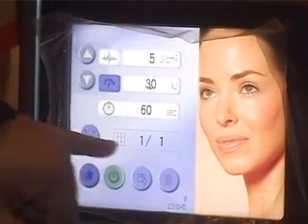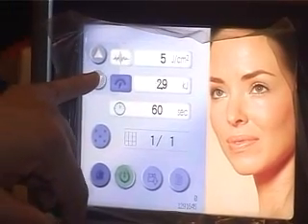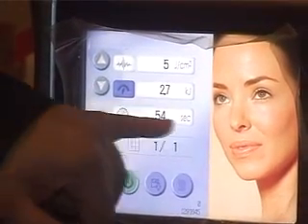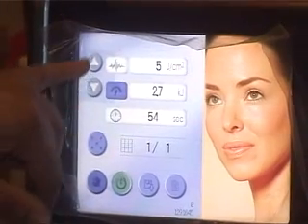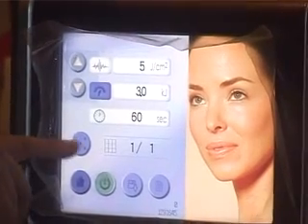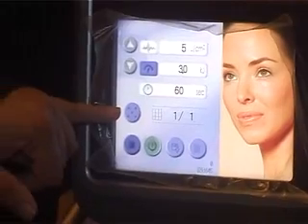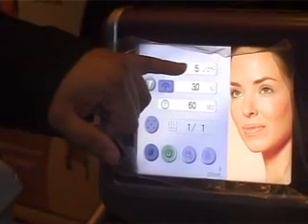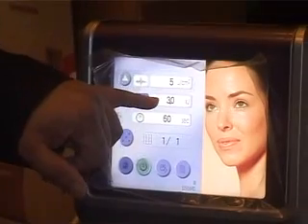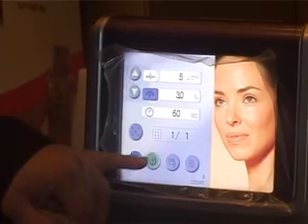Correspondingly there is a change in the number of seconds required to finish. If we reduce it, you will require 54 seconds; if we increase it, you will require more time. So 5 stack mode pulses per second will come in. We are going to deliver 5 joules per centimeter square per pulse, 3 kilojoules in total, which will get over in 60 seconds — that's very, very fast.